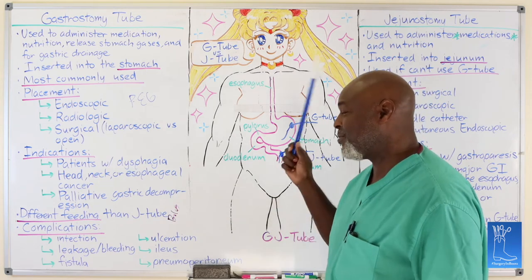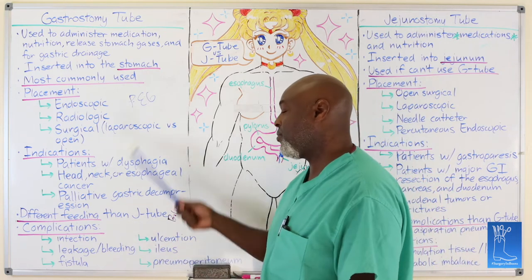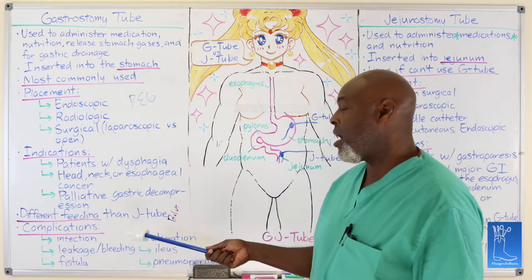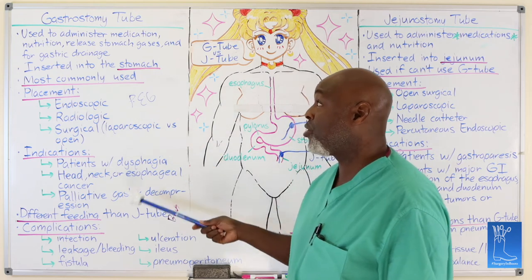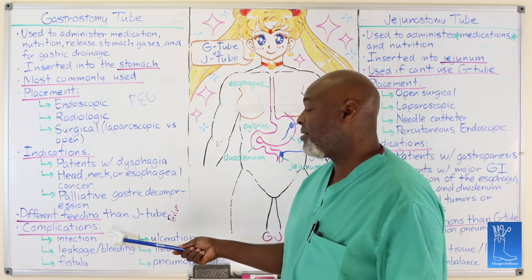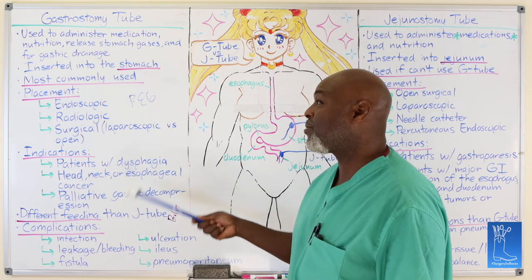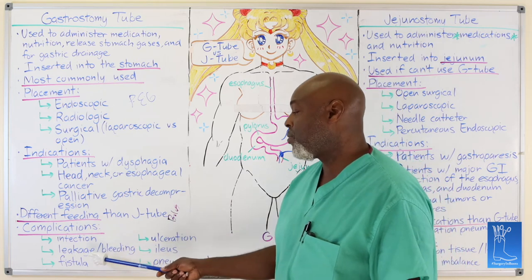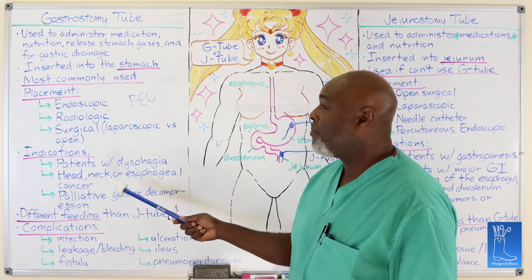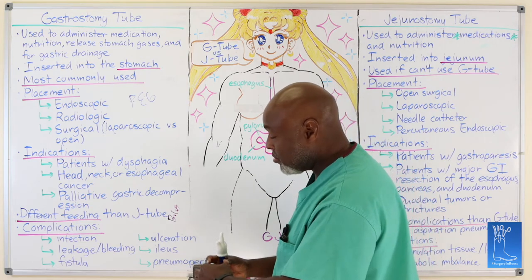So make sure you check with your doctor to see which ones you can and can't crush up. Now, complications associated with G-tube, you can get infections. This is primarily because these patients are traditionally malnourished, which means they don't have enough protein or nutrition to be able to heal, and that's why you're putting it in the first place, but they're prone to infections. They're also prone to leakage because the body can't heal completely around the G-tube.